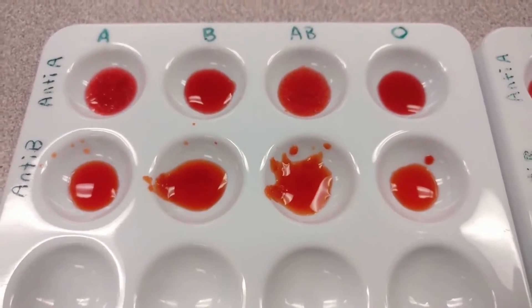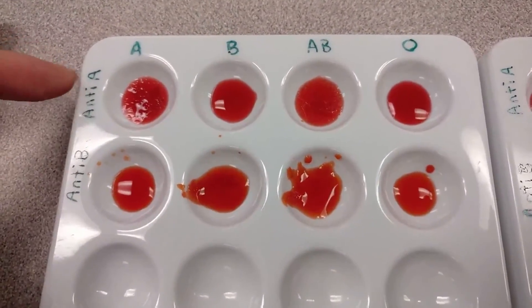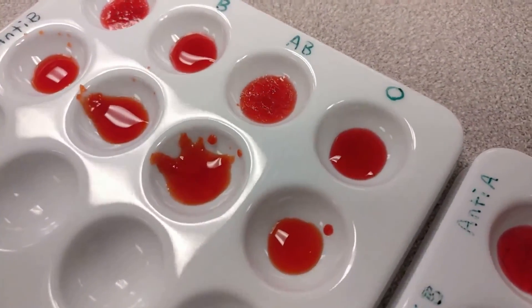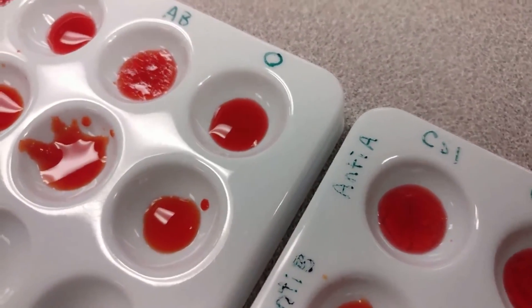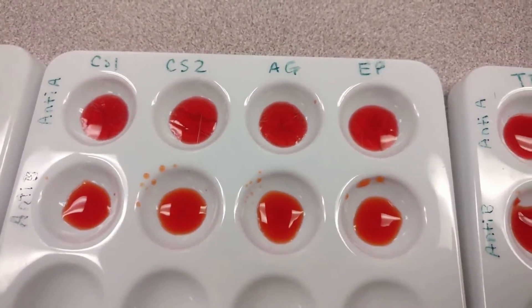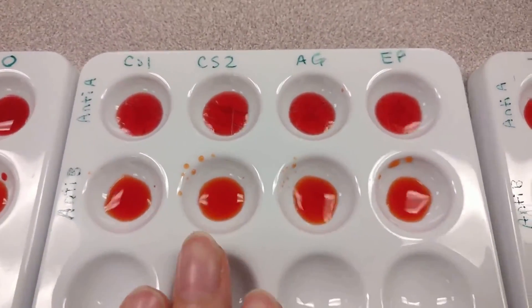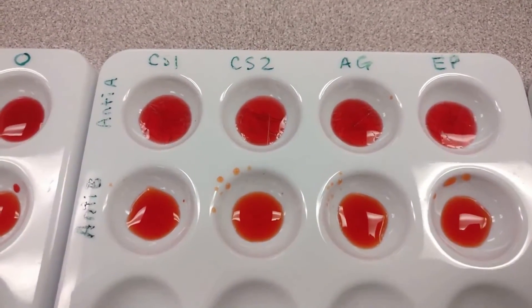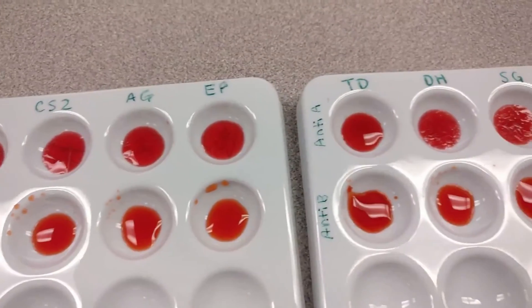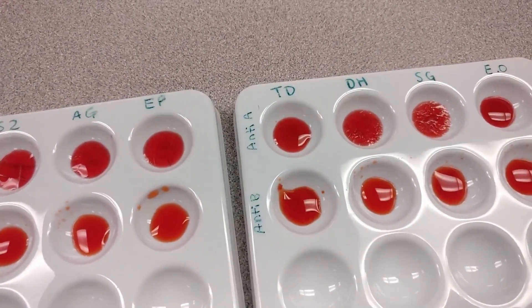Going back to the controls — remember these are positive controls. It makes sense that A only interacted with anti-A, B only interacted with anti-B, and AB clumped with both serums. O does not have any clumping in either serum. Using that information, you can then narrow down the individuals to those that have matching blood types to the ones found at the scene. First determine the type of blood found at the scene, then determine each individual's blood type, and you can narrow down whose blood it may have been.